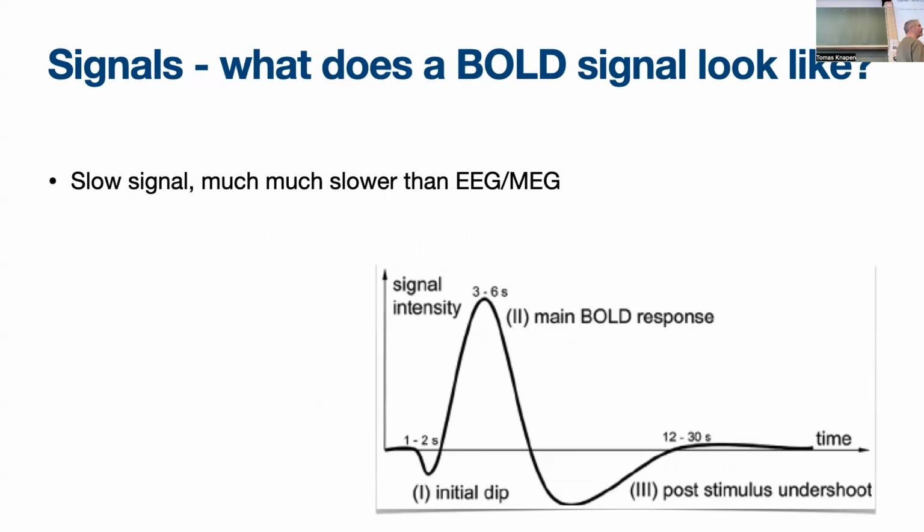It's slow, right? So if you want to do a fast experiment, do EEG or MEG. People that do EEG and MEG will say our measurement modality has millisecond time resolution. And they go like, yeah, right? Of course, then we have all these problems with different frequency bands and not knowing exactly where things are in the brain. So every measurement modality has its problems. And the problem with bold fMRI is that it has very bad temporal resolution. It excels in spatial resolution.